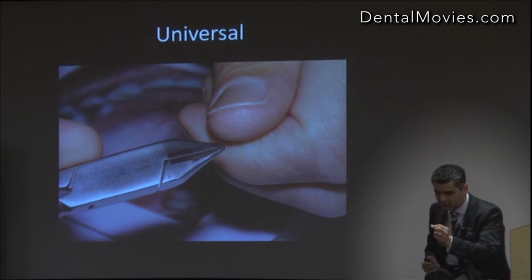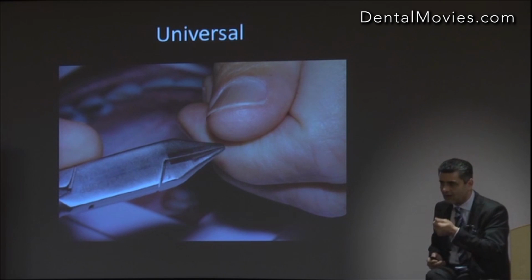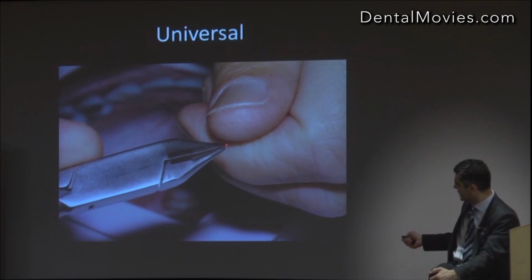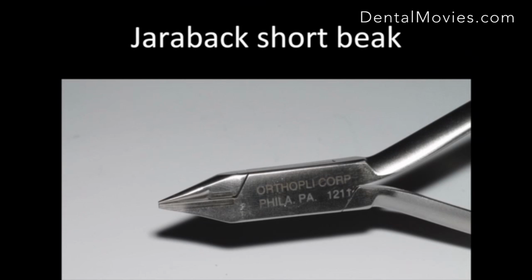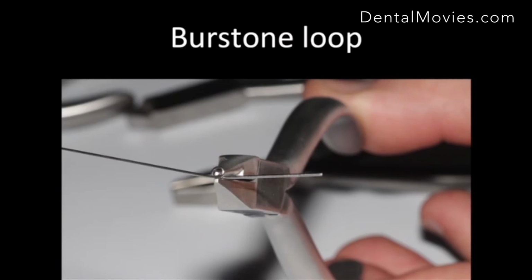Now what you don't want to buy is the short beak Jaraback, because it gives you less bendability. What you want is the long nose or long beak Jaraback. Right, so write that in your notes. First plier I want you to have is a long beak Jaraback plier. You don't need the short beak one, because if you know how to use the long beak one, you just bend here rather than there and it's got a short beak.